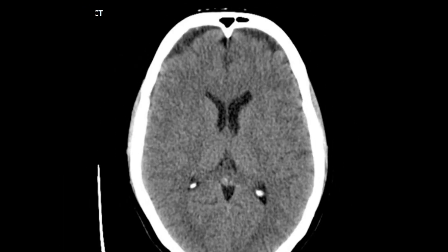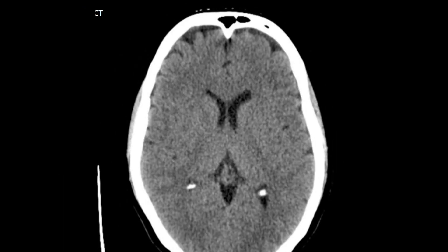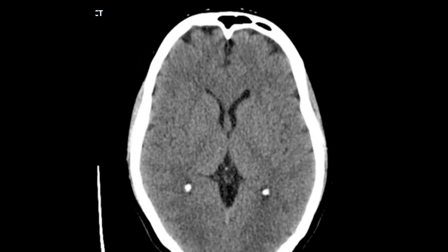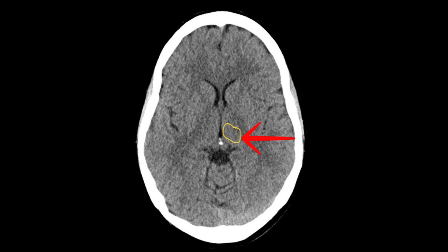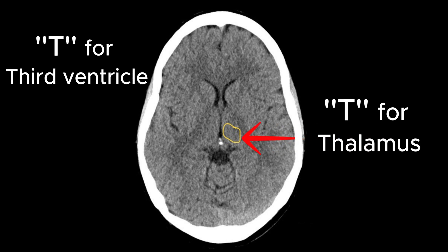Now to visualize the thalamus, let's scroll down at the level of the third ventricle. This here is the thalamus lying lateral to the third ventricle and posterior to the internal capsule. You can remember this as T for — thalamus lying at the level of the third ventricle.